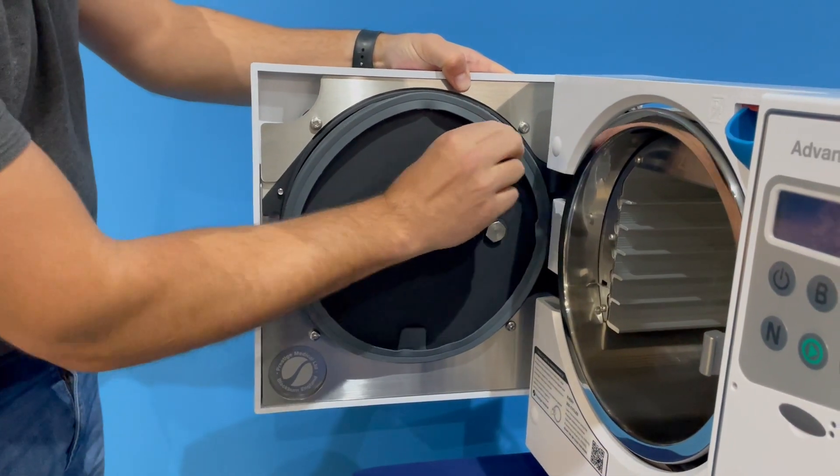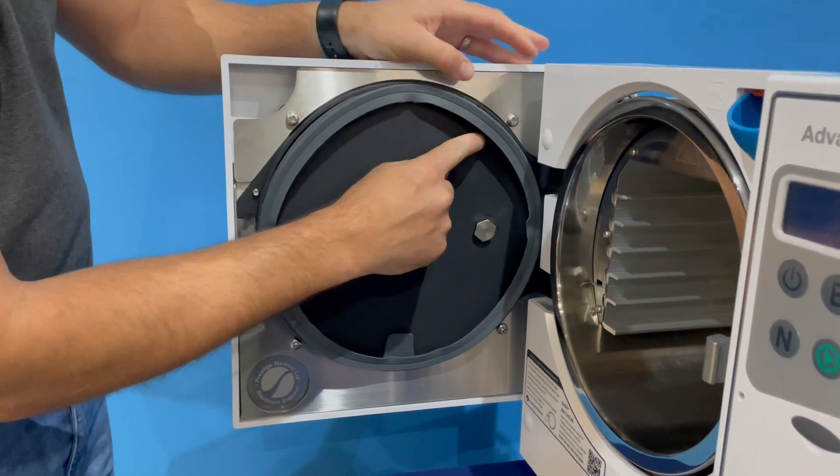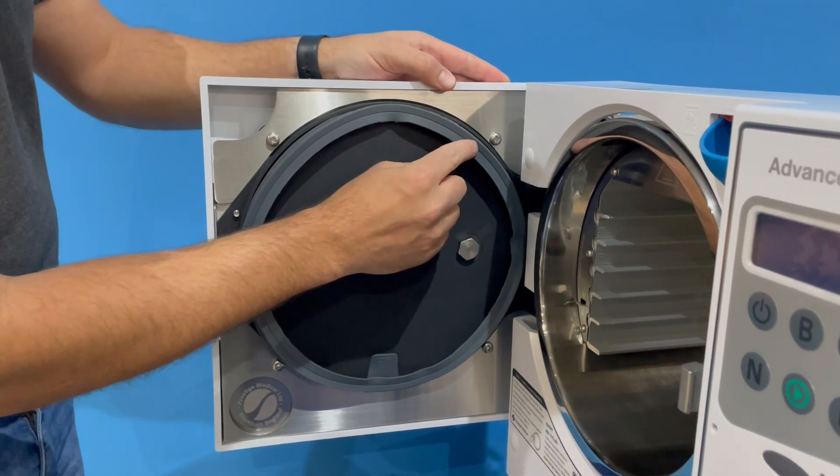And if you notice, when I'm sliding this, I'm not actually coming down vertically — I'm coming down at a slight angle. This just makes it a little easier to slide the actual gasket in the groove itself.